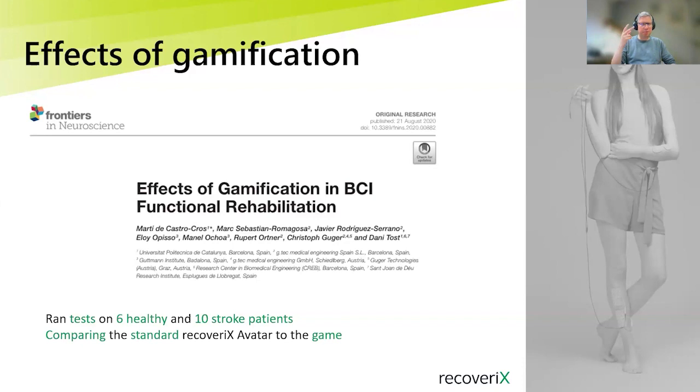And what we did is 2 things. We had a look if the BCI accuracy is negatively affected. This would mean that maybe the game is too distracting from the real task. And secondly, we also looked, of course, at the level of satisfaction of the users to see if they enjoy playing the game.